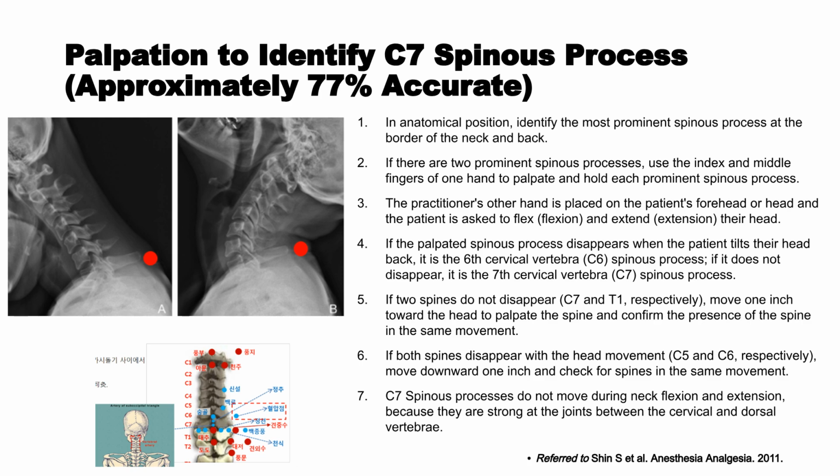This brings us to the core of my talk. We need ultrasound imaging of the gross anatomy for 2 reasons: to ensure the safety of our needle therapy and to ensure the accuracy of our procedure, which boosts treatment efficacy. Let's look at one example: finding C7 in the neck, GV14 region.